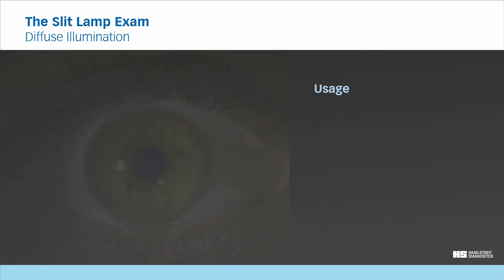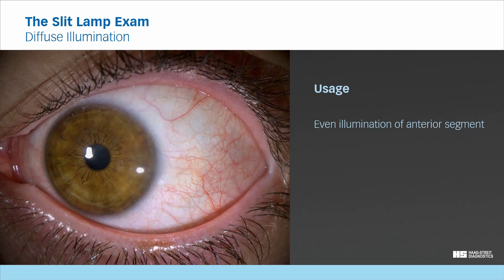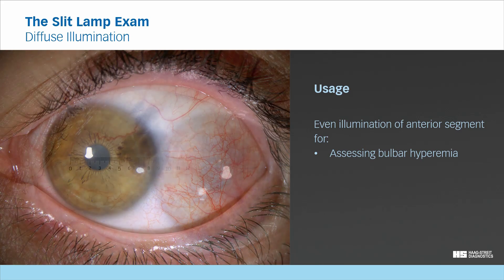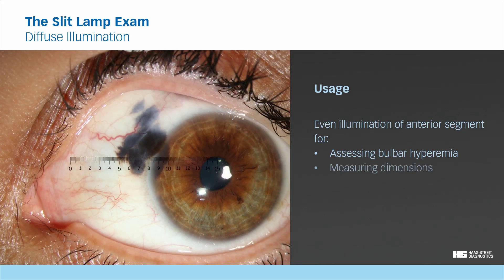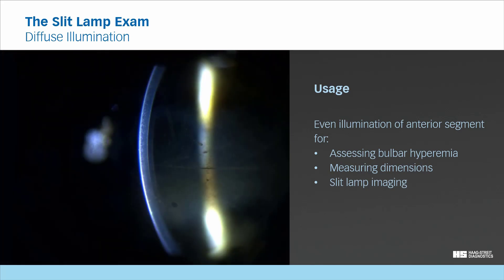Usage. Diffuse illumination is mainly used to achieve an evenly illuminated overview of the anterior segment and external eye. This is useful for assessing bulbar hyperemia or for providing even illumination when measuring dimensions with a dedicated measuring ocular. Furthermore, it is used in slit lamp imaging where the additional diffuse background illumination provides relevant clinical information to the still image. For comparison, here is the same image without diffuse background illumination.